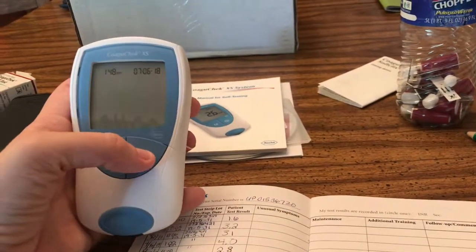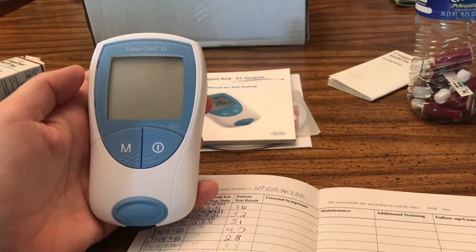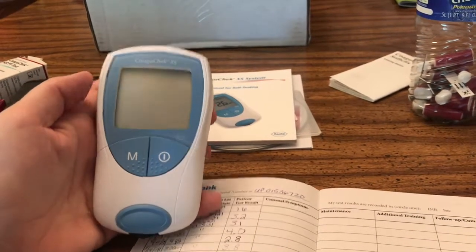All I need to do is power it off by pressing the button once — and it's turned off. All we need to do now is call in our results. I hope that this video was informative and helped you out if this is a new system you're using. Hopefully this helped walk you through the process. If it did, give me a like, leave me a comment, let me know what you're thinking. I appreciate you watching — have a great day.